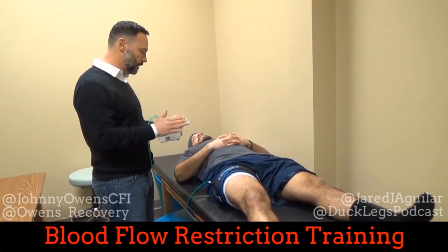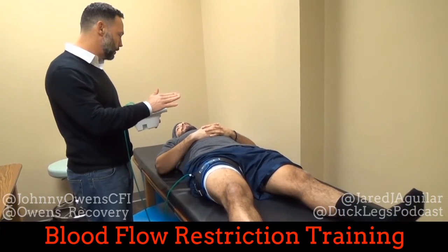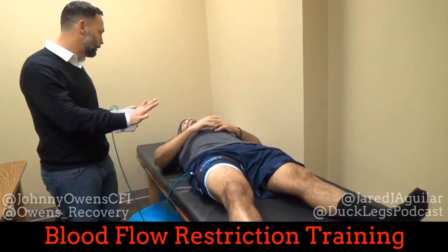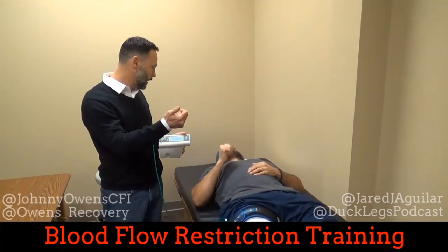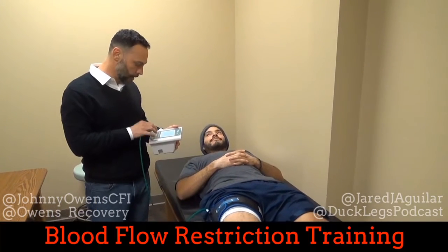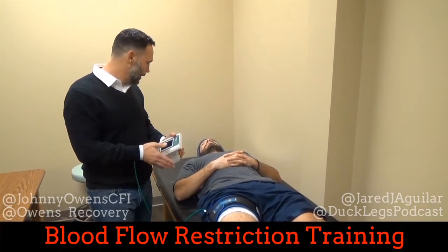The Doppler is really sensitive. It measures the sinusoidal arterial wave flow, so you've got to be really quiet. This is like the hardest part for patients — getting them to put down their phone for about 30 seconds to do the Doppler. The device needs to be charged up for this.